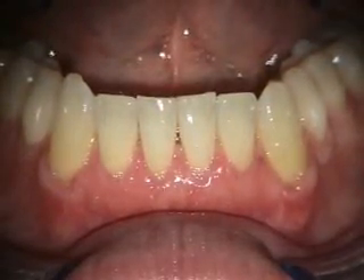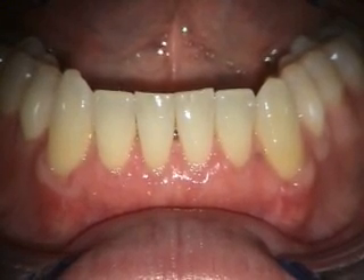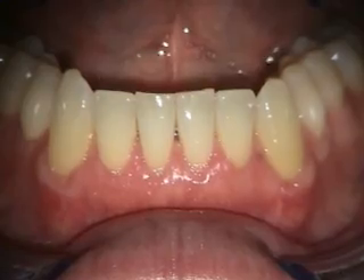This is a two-week healing of the alloderm grafting that we did from 22 to 27. We'll be taking a look at this again in a couple of months.